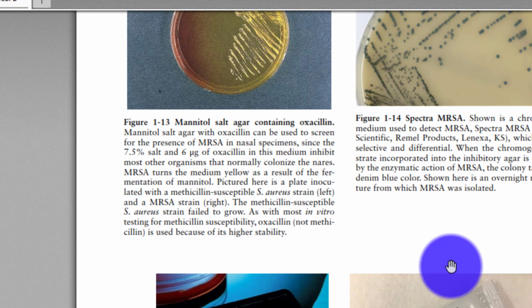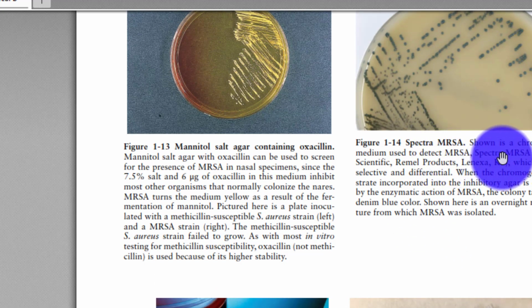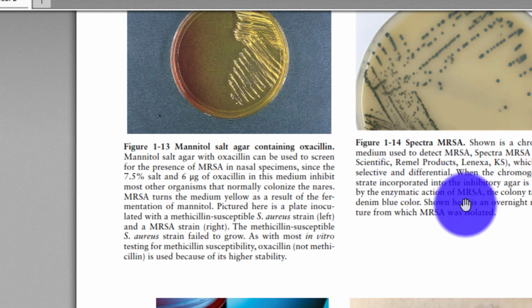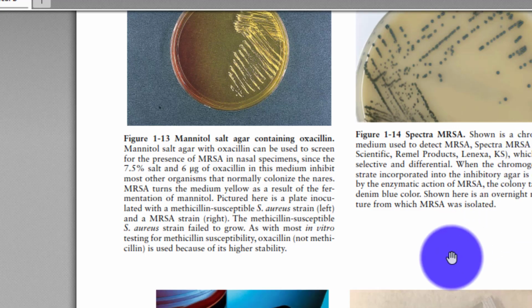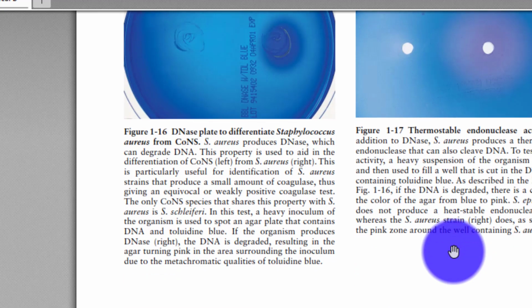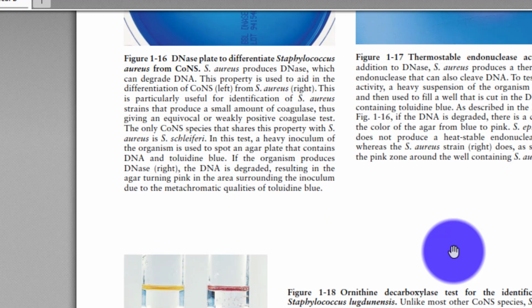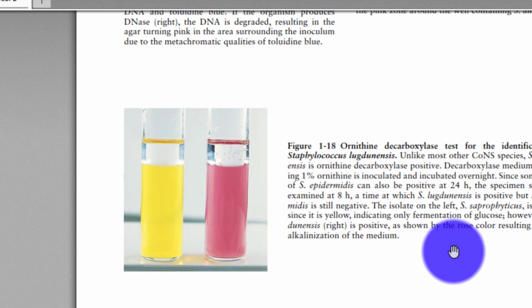Here is Spectra MRSA, shown in chromogenic media used to detect MRSA. Thermo Scientific. DNase plate to differentiate Staphylococcus aureus, thermostable endonuclease activity. Ornithine decarboxylase test for identification of Staphylococcus lugdunensis.